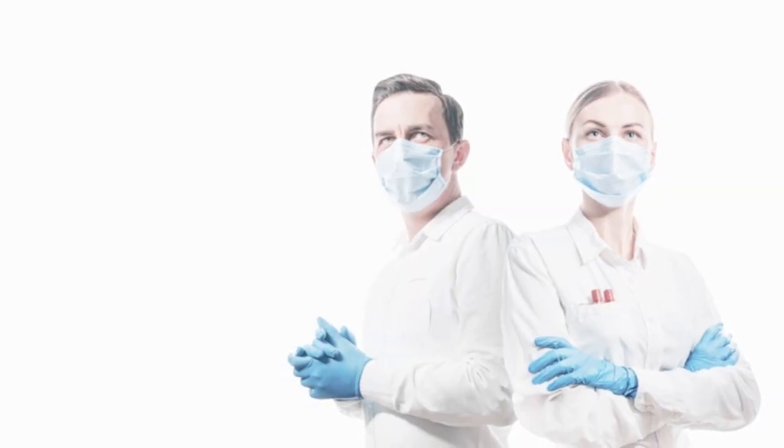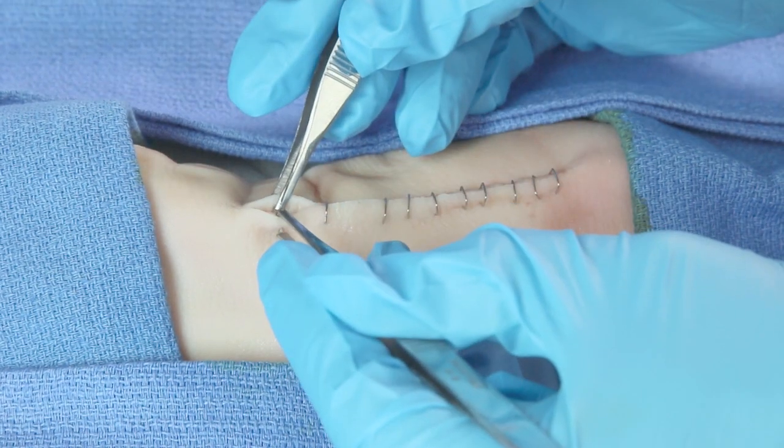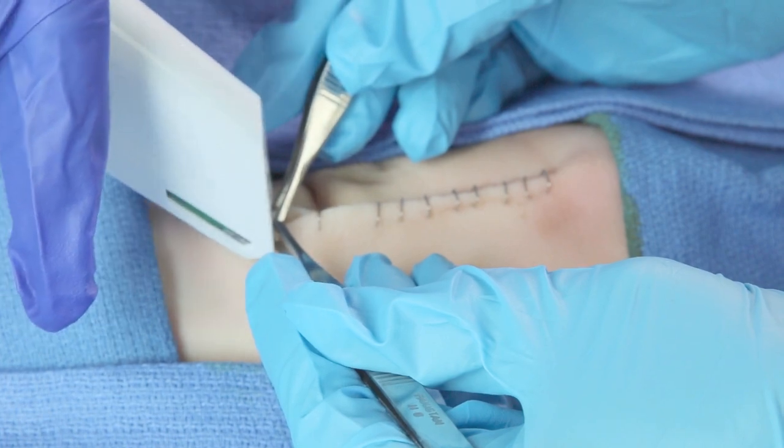However, unlike surgical procedures which need only one medic, the best staple results occur when two people are involved: an assistant to align the skin with forceps, and another to apply the actual staples. In fact, in a staple procedure, the assistant is the skilled laborer. I'm not saying it can't be done by one person, but it looks better in the end if you have two.